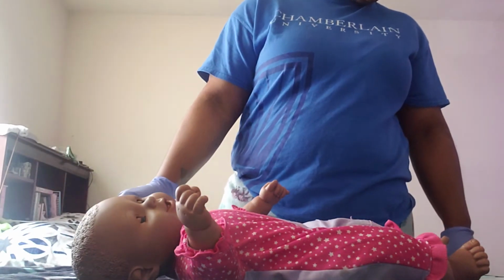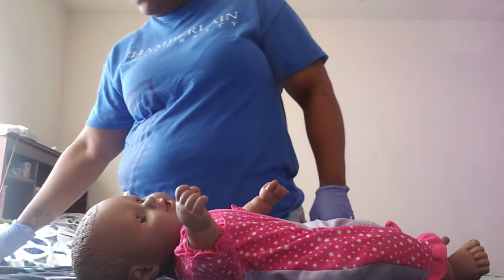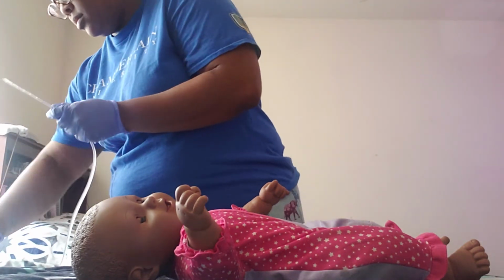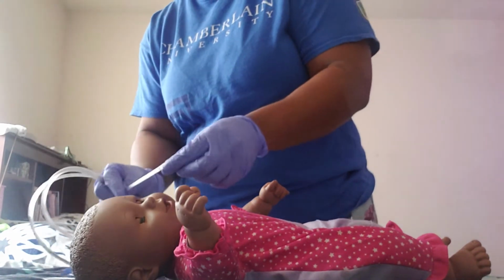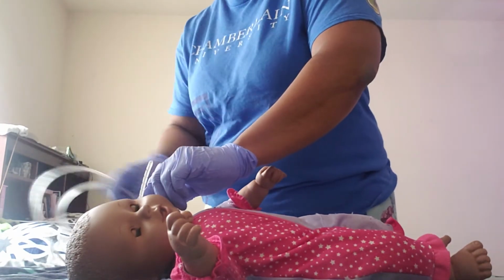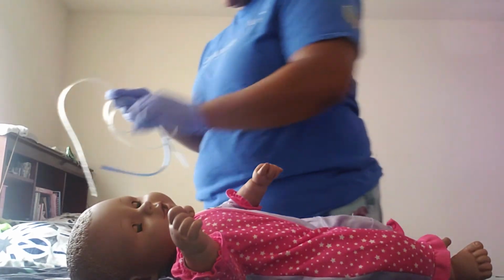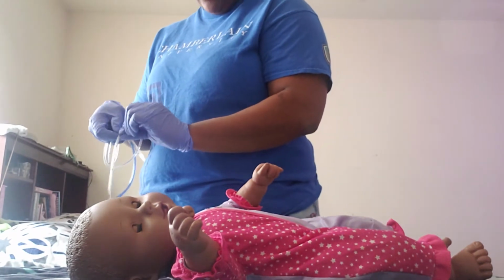After that, I'll go ahead and get ready to measure the NG tube on my patient. I will measure from the tip of the nose to the ear. And then I will take it from the ear to the tip of the xiphoid process. Then I will take a marker and mark where I need to, and that's where I will insert up to.